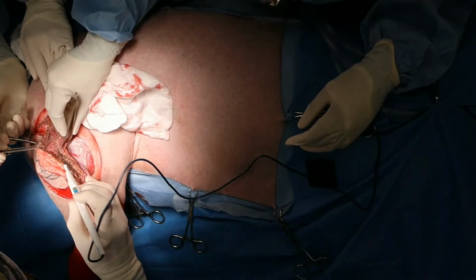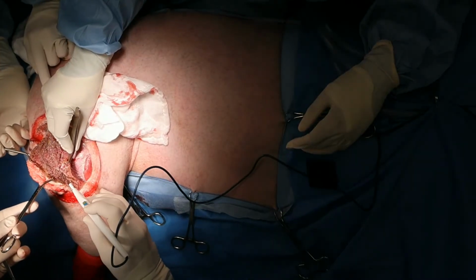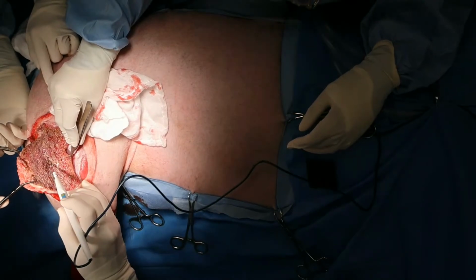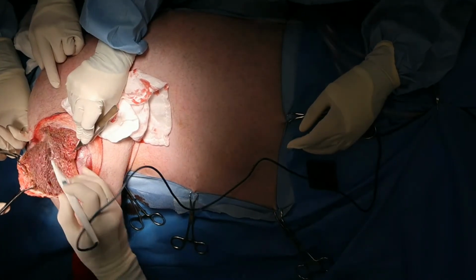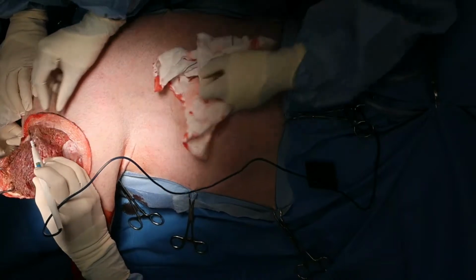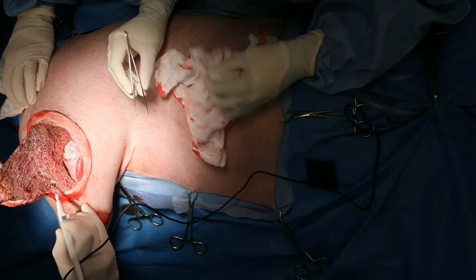And I will infuse all of this with bupivacaine, because I think that cutting through the muscle can be quite painful. And I've done an epidural on this dog as well. Whenever you're doing any kind of surgery, one part of your checklist should always be, is there a local block that I can do? Because local blocks with a sodium channel blocker like lignocaine or bupivacaine are the most effective pain relief you can achieve, and also have the least side effects and least effect on cardiopulmonary function. So I know I've done an epidural, but I've got this big cut surface of muscle here, so I'll probably go ahead and do a local block as well.